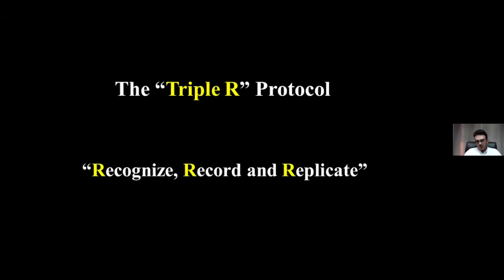I would like to highlight that this protocol applies to composites, zirconia restorations, lithium disilicate restorations, whether you are using a staining technique, a micro-layering technique, a cutback technique, or a full layering technique, it doesn't matter. It's a protocol for mimicking natural teeth.